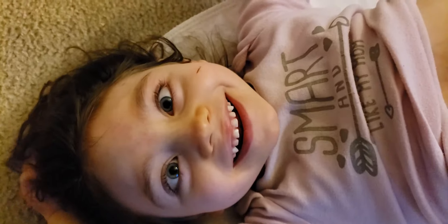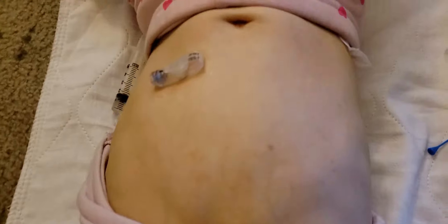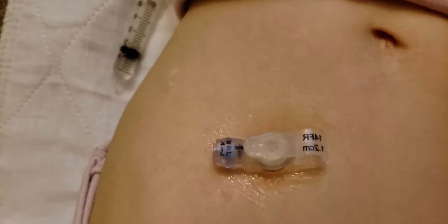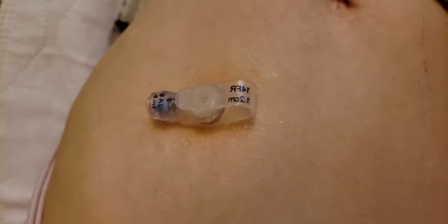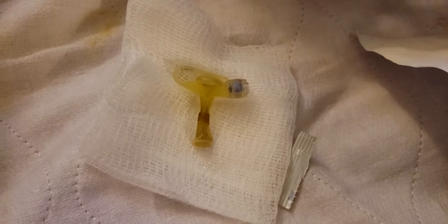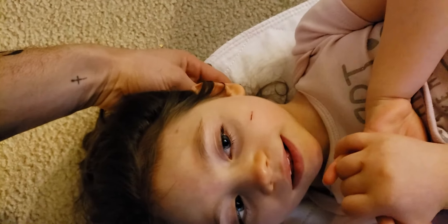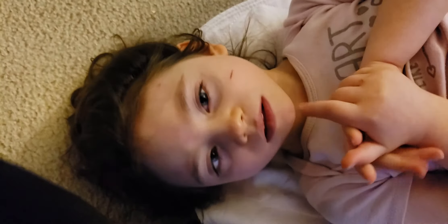It can be very intimidating and look very scary. Taking out the old one, you could see that definitely needed to be changed — the balloon was actually green from the PediaSure, which is kind of gross, but it's done. Fresh, brand new, and it will need to be changed again in three to six months. Annabella's good to go — say bye bye!